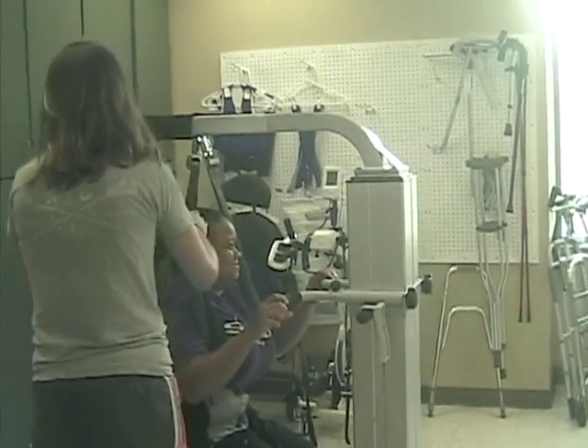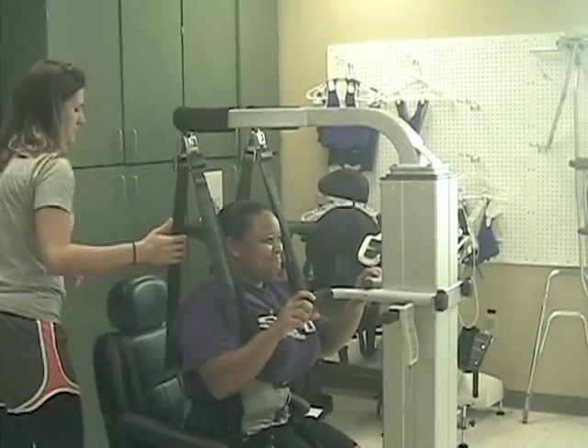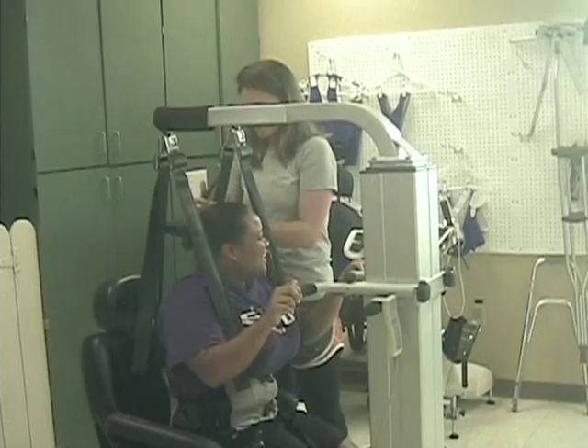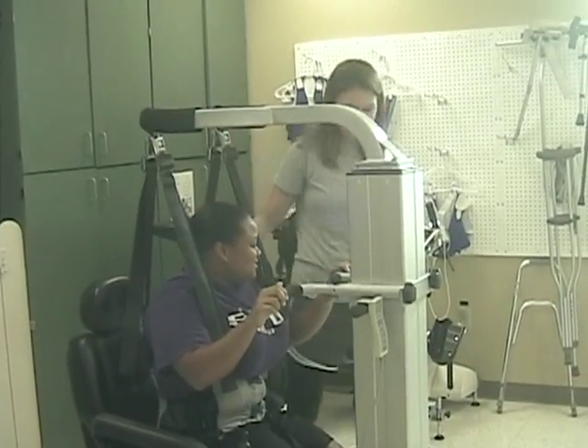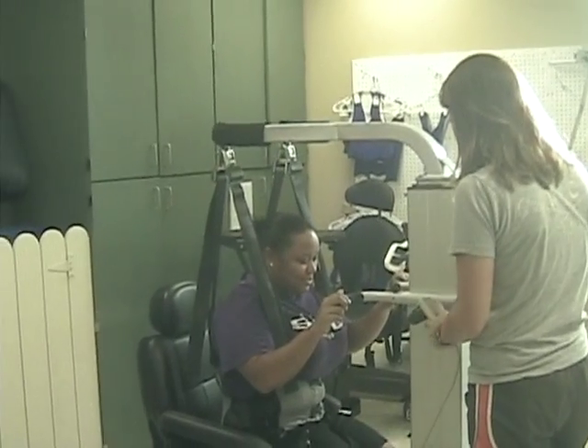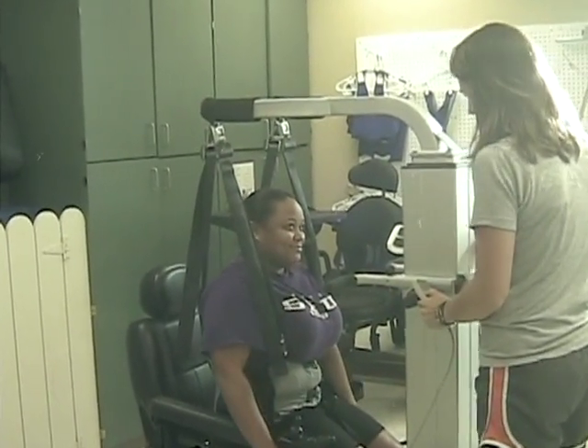This is the light gate. The light gate was the first body weight support system and has been considered a revolutionary breakthrough for rehabilitation services. Your patient will be ready for their gait training once the harness is secure and attached to the lift component of the system.